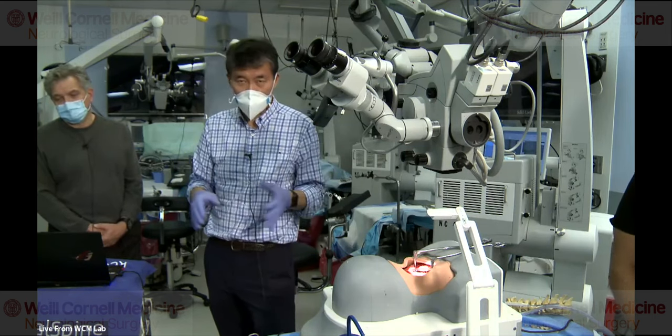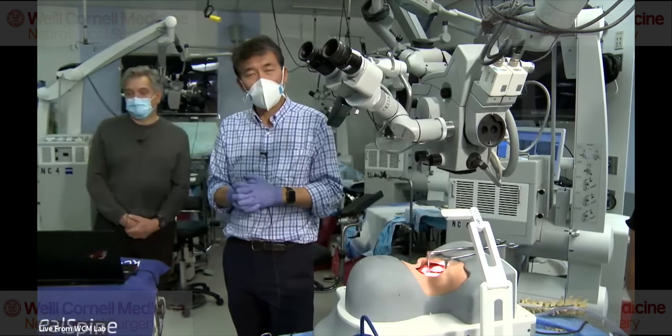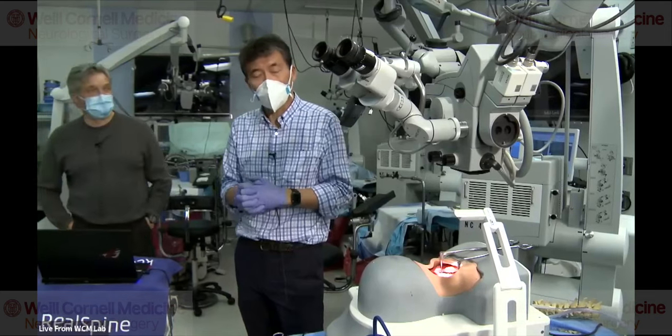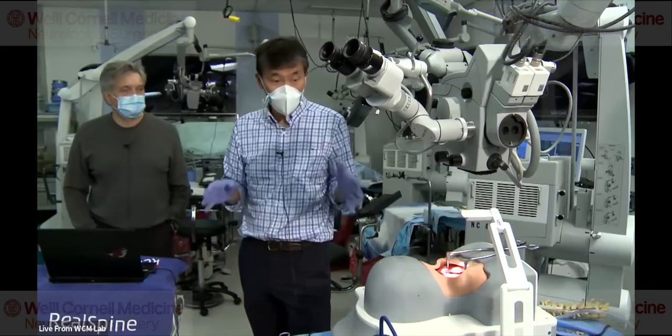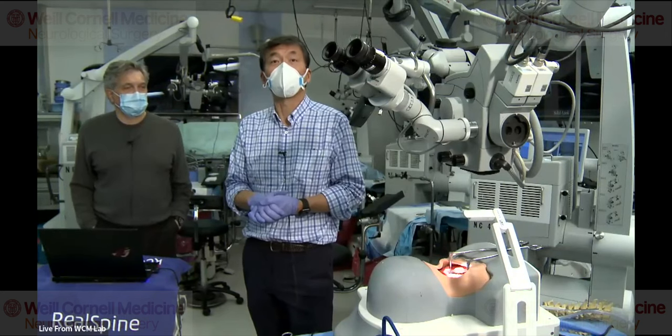You wouldn't want to cut through it. You wouldn't want to macerate it. You'd want to keep it nice and moist so that it maintains its integrity. If you do that, then patients will not have that much pain. They will heal faster, and they will be able to extend their neck.